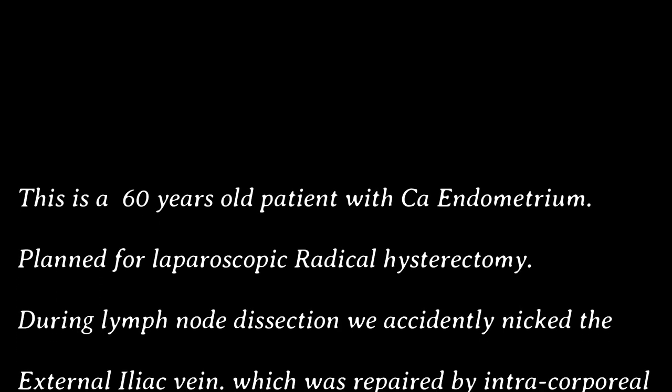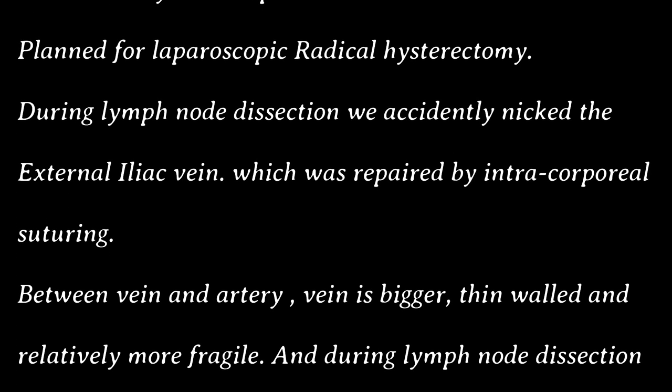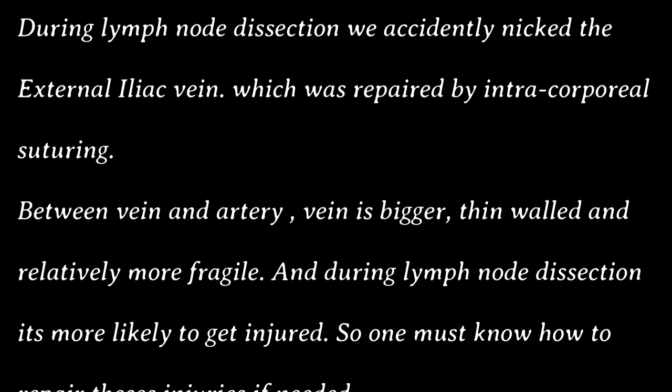This is a case of a 60-year-old patient with CA endometrium, planned for laparoscopic radical hysterectomy. During lymph node dissection, we accidentally nicked the external iliac vein, which was repaired by intracorporeal suturing.